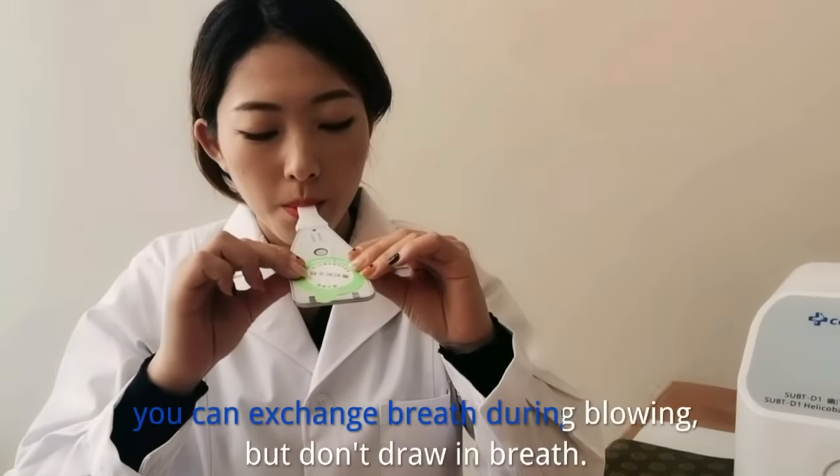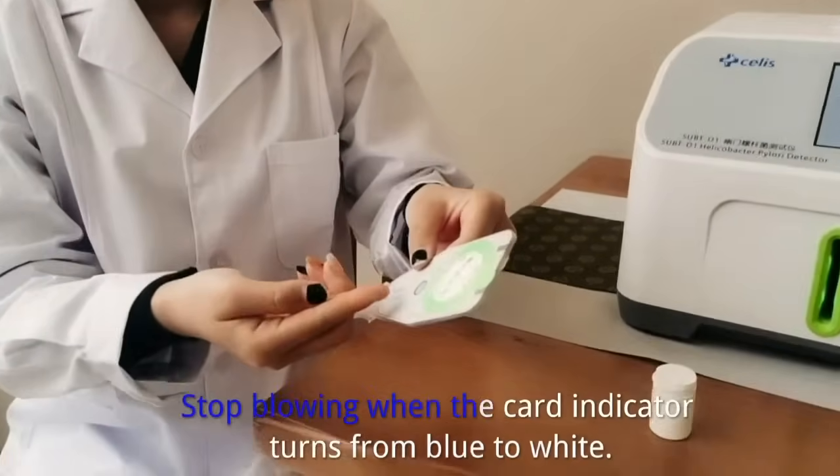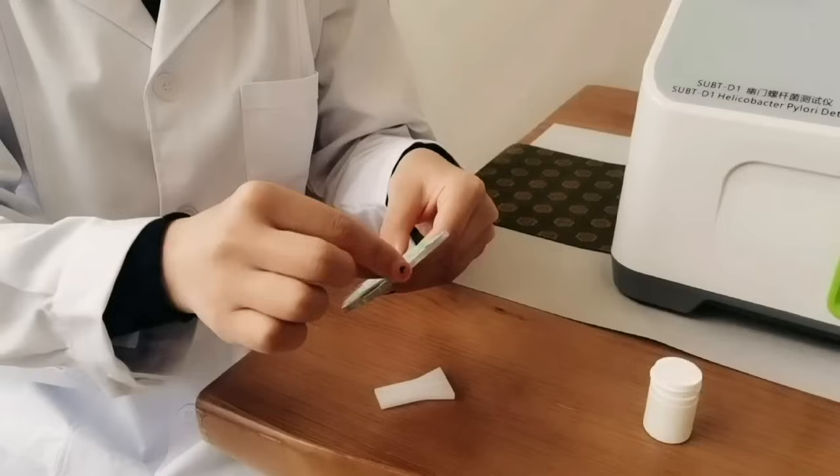You can exchange breath during blowing, but don't draw in breath. Stop blowing when the card indicator turns from blue to white. Then take out the mouthpiece and give the breath card to medical staff.